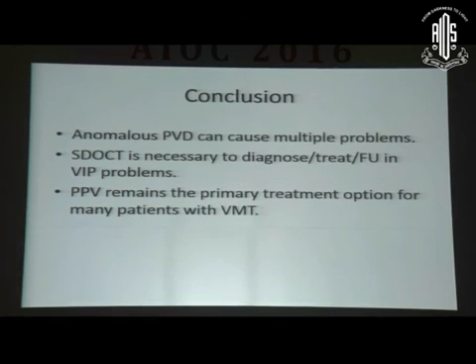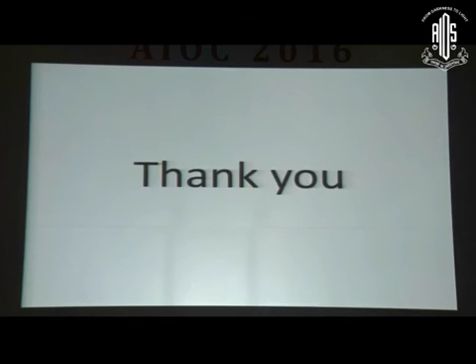Okay, so to conclude, anomalous PVD can cause multiple problems. SD-OCT is necessary to diagnose, treat, and follow up the various VMT problems, and pars plana vitrectomy remains the primary treatment option for many patients with VMT. Thanks.